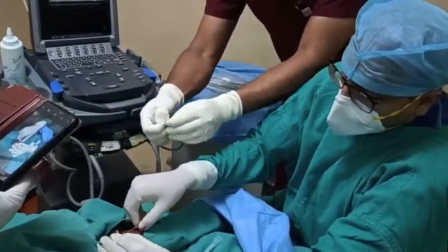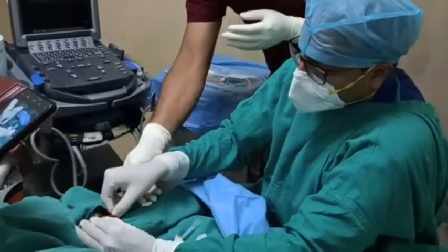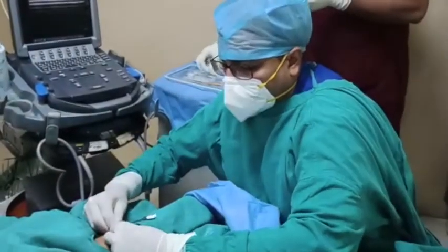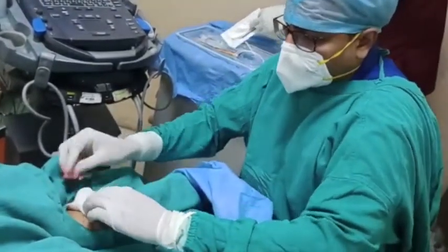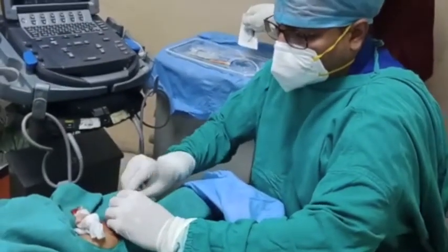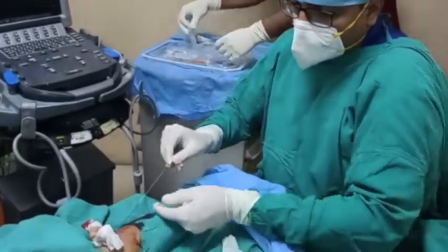We remove the dilator and then introduce the catheter along with the stylet. We break the sheath. We then have to remove the stylet which is inside the catheter.